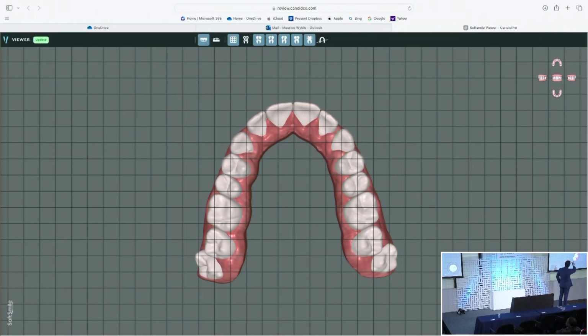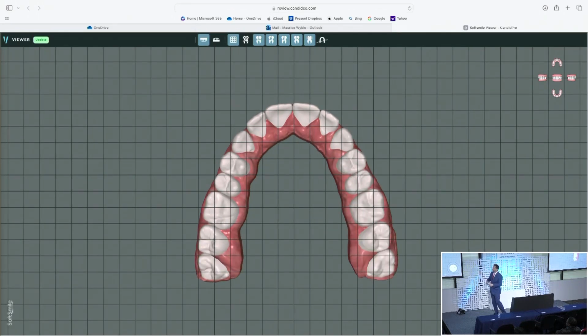So we've got 5, 10, 15, 20, 25, 30, 1, 2, 3. Maybe we're at 33 or 34 between 3 and 14. This is the beginning of round 2. We did 15 aligners. She started out with 31. We're at 33 or 34. But now that the wisdom teeth are there and I want to go wider, we'll go to the press play or final to get to the ending.